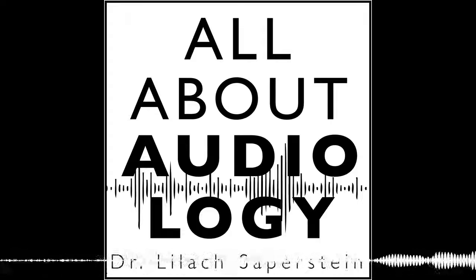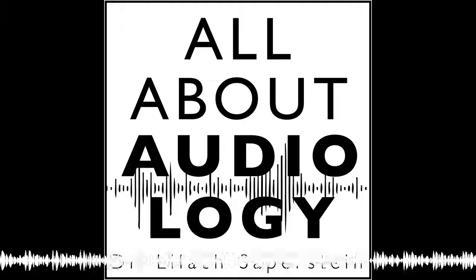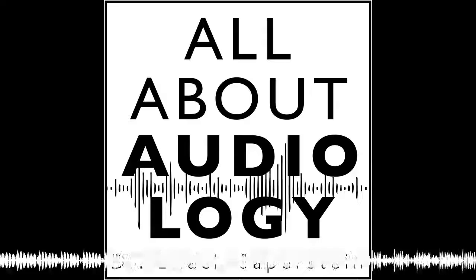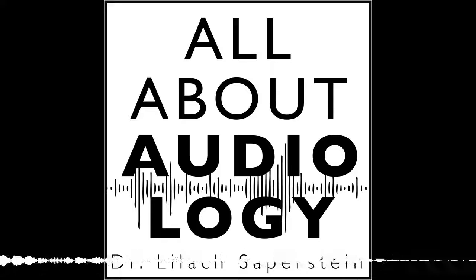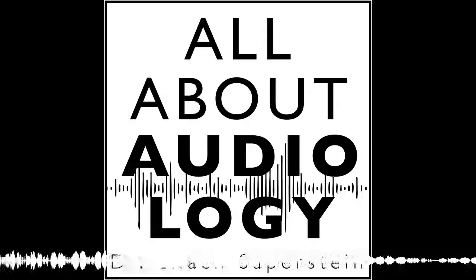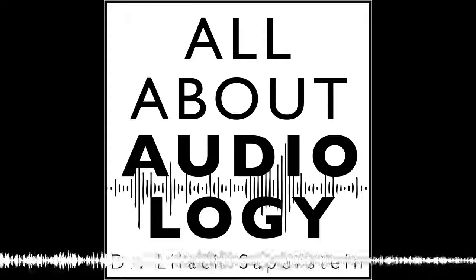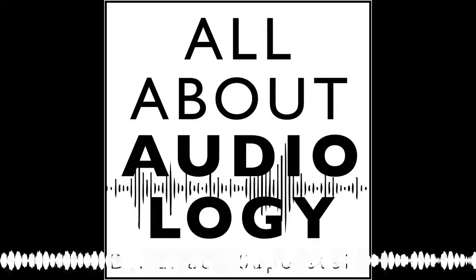It just doesn't happen. I mean, this is such a great pediatric tip in general, like a big protocol, because I've heard about this idea of having parents come into the test booth for sound field testing so they can be present, hearing the sounds that perhaps their child is not responding to at various levels, and then they can understand it, like they have heard and seen what's missing there. But from the earliest ABR, to do that with them, that's something that I'm going to consider now and include, because it is very much, you stay quiet for half an hour or 45 minutes, just keep that baby sleeping. And then, because we're in a rush too, you're kind of always balancing those two things in the appointment.